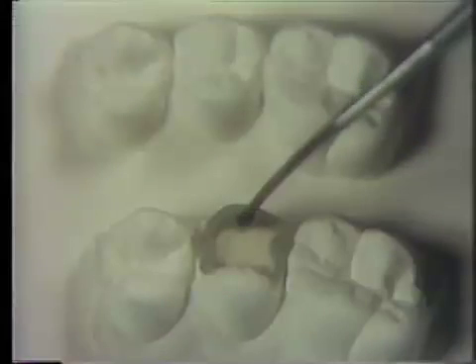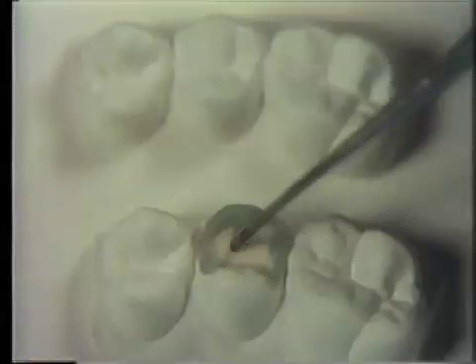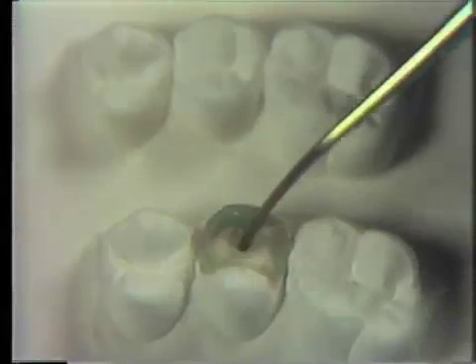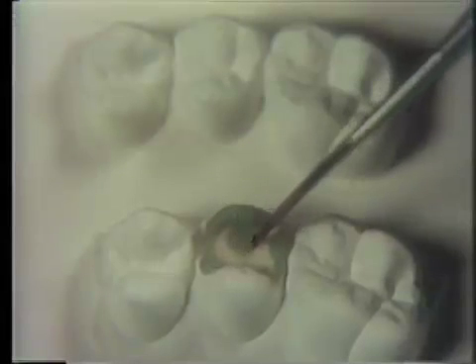Next, develop the triangular ridge. Draw out wax from the base of the cusp cone. Add sufficient wax to develop the convexity of the triangular ridge. Several repetitive increments will have to be added to achieve this. Slightly over-accentuate the contour to complete the triangular ridge.